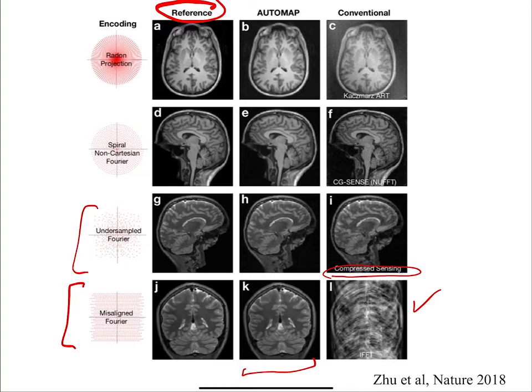The deep learning networks basically come up with a probability distribution of the world and the probability distribution of what the parameters could be, and it says, well, if the object is from this world, then it probably is going to satisfy these things. Now, those of you who know deep learning, there's still a lot of debate about how easy it is to trick deep learning networks, whether you could come up with something that's totally bad. So the vendors have spent a lot of time validating this, and what I've heard from them is that they feel confident. I think the FDA maybe just approved their first deep learning application to MR this year or maybe early next year. All right.